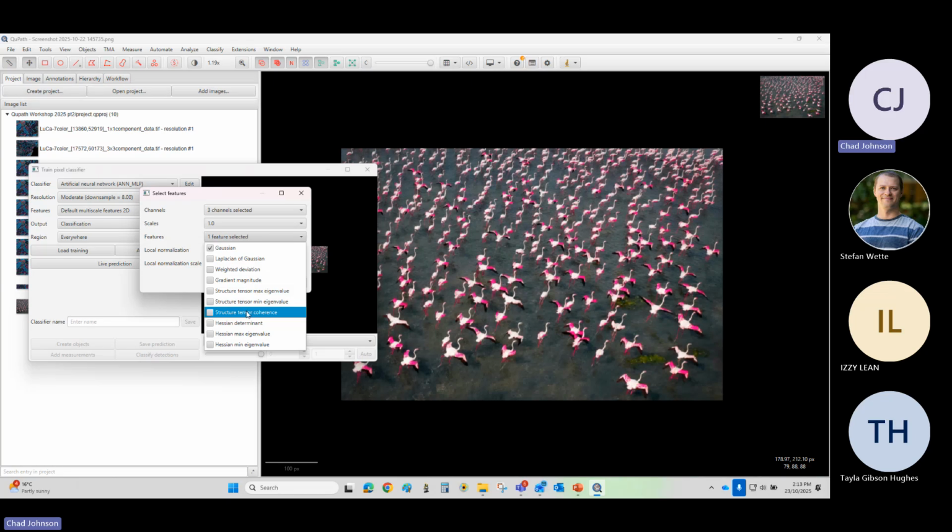In the case of Gaussian blur, it blurs the data into a more, I don't know, palatable format that the algorithm can actually look at. You can turn this off, but I find that turning it off uses a bit too much computing power. But if you blur it a little bit, the function works a lot better.